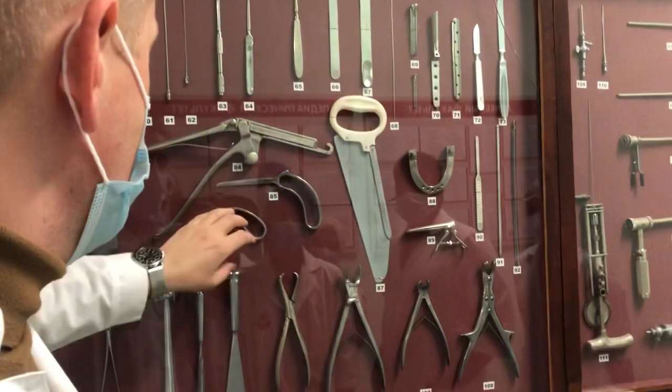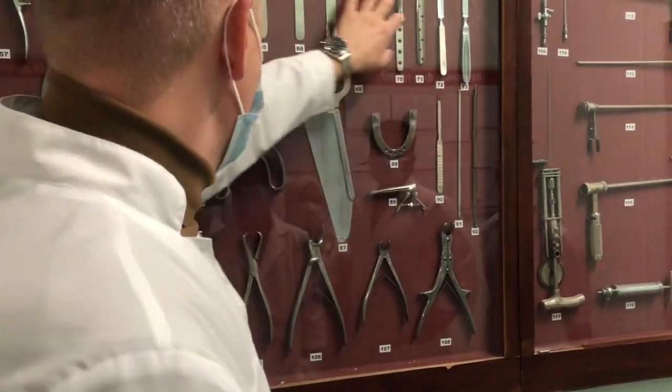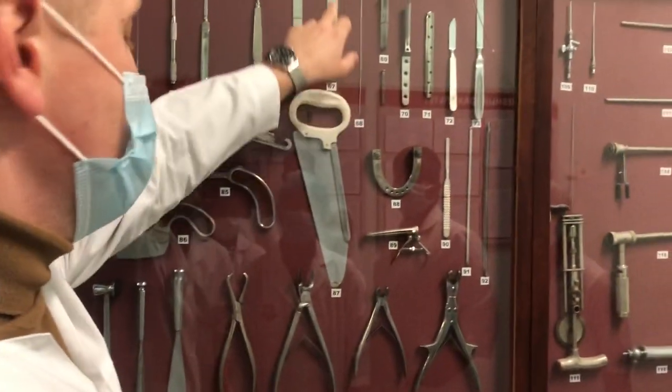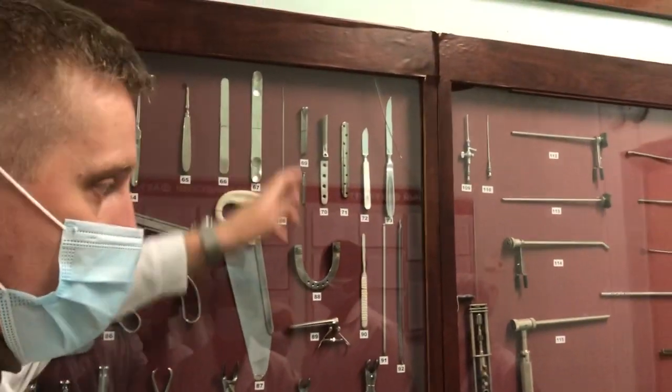And the last thing you should know is here, because there are instruments for next semester — maybe except this one, our neurosurgical spatula, which we studied too. That's all.